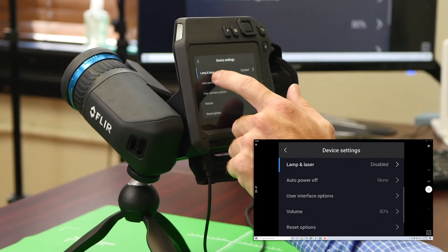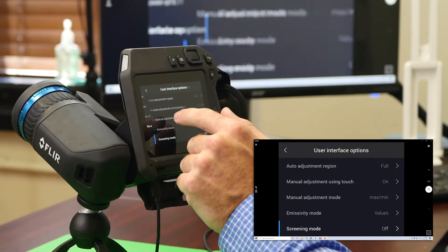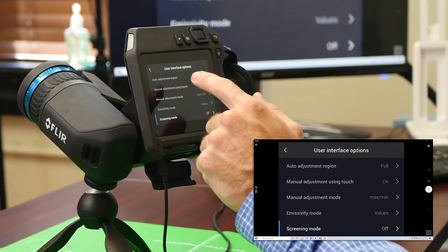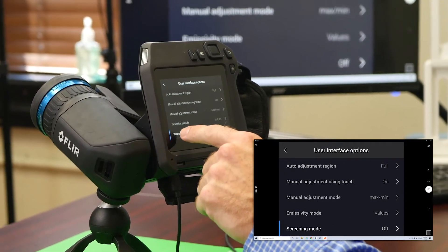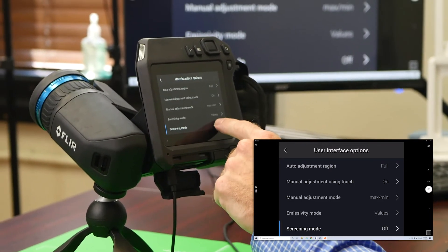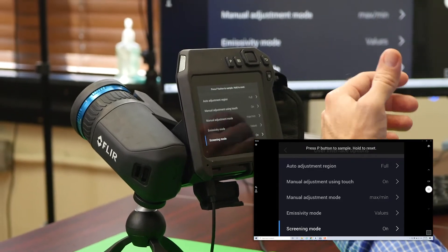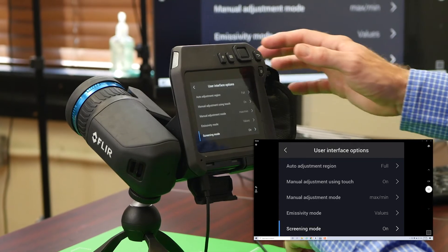After you have that disabled, you're going to scroll down to where you see user interface options. Here, we click into it. It'll bring you into another screen. You're going to see menus, and you go down to the bottom where it says screening mode. Here, you click it and turn it on. Now you're beginning to set up the process for the screening mode.